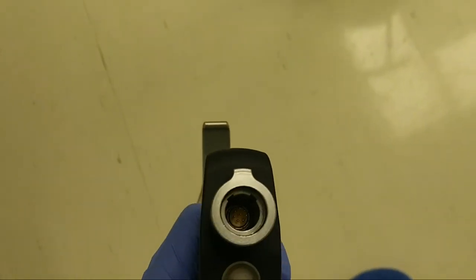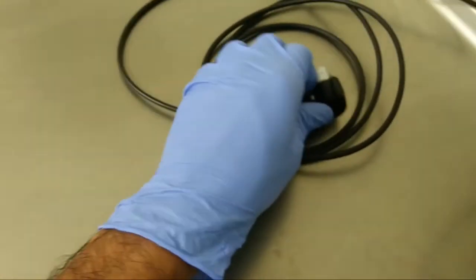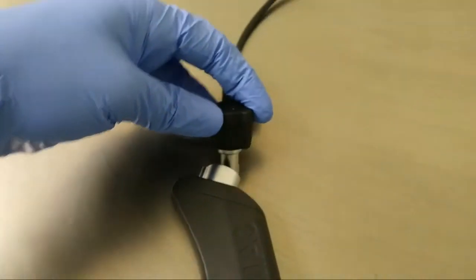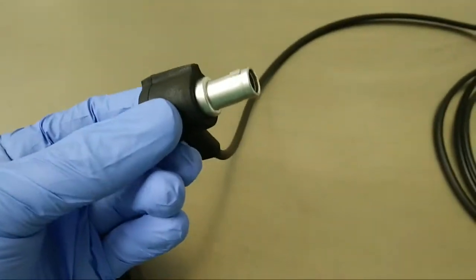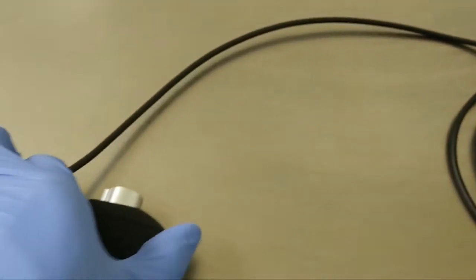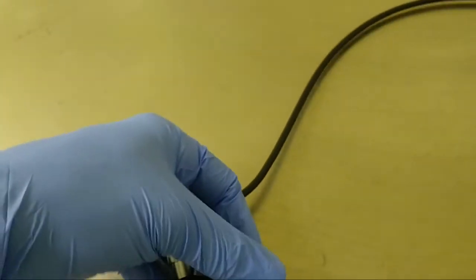This is a port to attach the cable to the monitor. The D blade is specially used for difficult situations. Its angle is made very specially. This is reusable. This is a marking showing how to attach the cable to the handle. The D blade is specially made for less mouth opening, obese patients, low thyromental distance, short neck, etc.